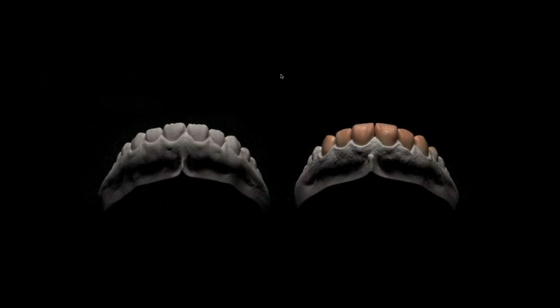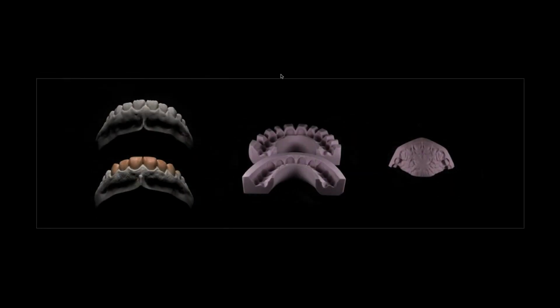And also here you can see the before and after wax-up, which is what I'm sending to my dentist. It's always before and after, with some silicone keys so that he can transfer this wax-up to the mouth as a mock-up.